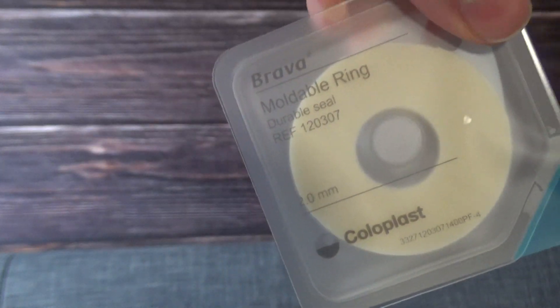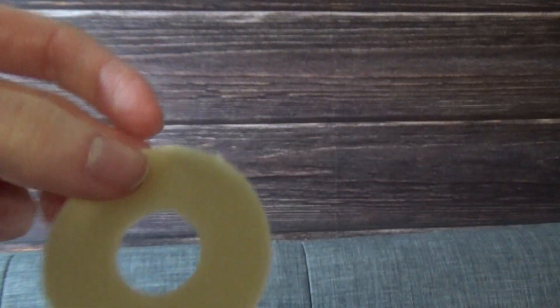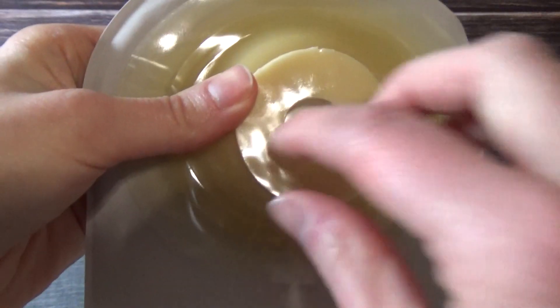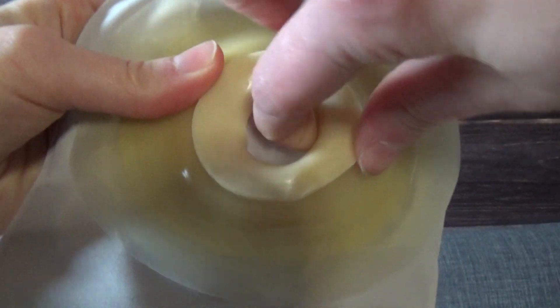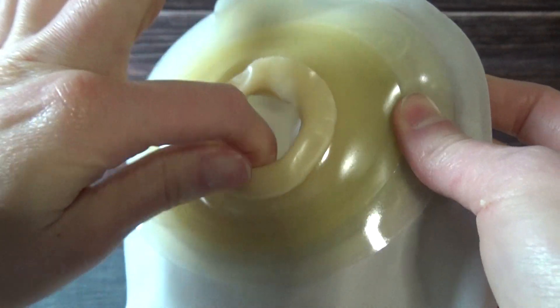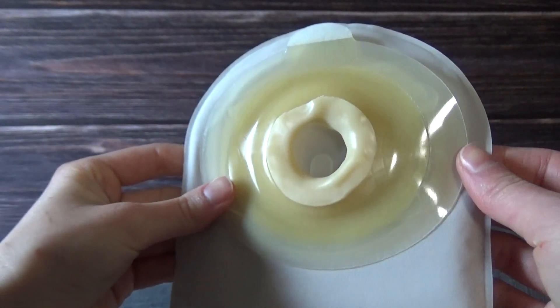Now we're going to put on the Coloplast Brava moldable ring. It has little strips that you pull off, leaving you with a flexible ring that you place around the circle where your stoma will be fitting. Press it right here — perfect — and start folding it in. Some people like to put this ring around the stoma before putting on the bag, but this method works better for me personally.